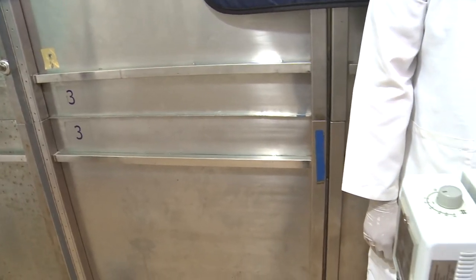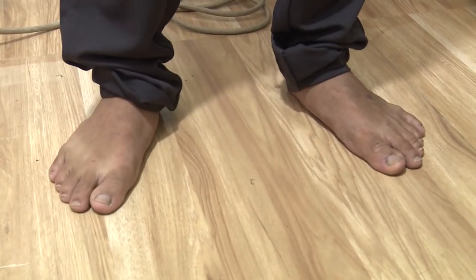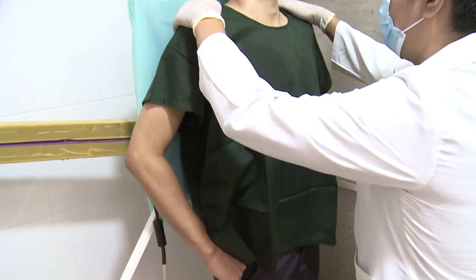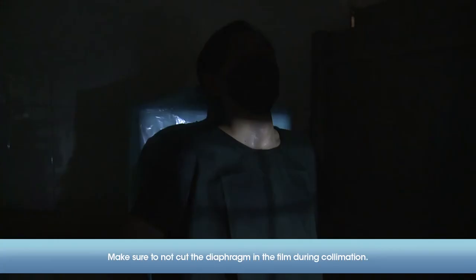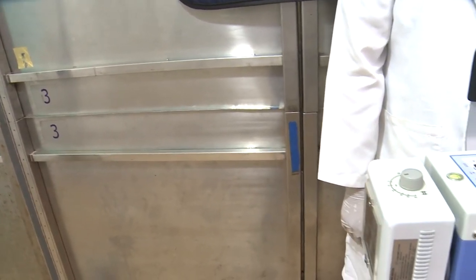2. To take a chest x-ray in the anterior-posterior (AP) position, have the patient stand upright with their back against the IR plate. Ask the patient to spread their feet slightly to evenly distribute their weight. Check that the upper border of the IR is approximately two inches above the patient's shoulder. Have the patient raise their chin to prevent superimposing lung apices. Position the CR at the nipple line and check that the alignment of the CR and IR are centered. Place both of the patient's hands on their hips and have their elbows bend back toward the IR as much as possible. Place the right or left marker in the upper corner of the IR. Collimate the four sides of the lung fields. Ask the patient to not move, then go to the control panel to take the x-ray.